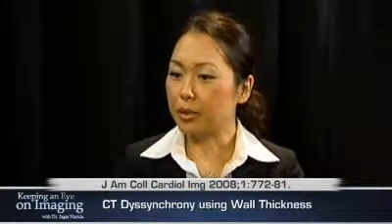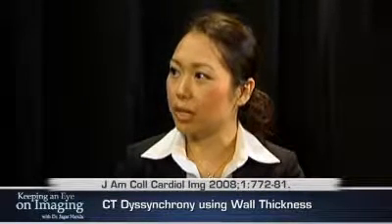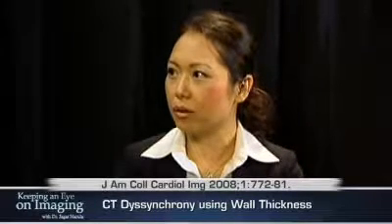So in our study, we report a new method to quantitatively assess left ventricular dyssynchrony using cardiac CT. What was also new about the method is that we evaluate changes in wall thickness over time instead of wall motion or volume.